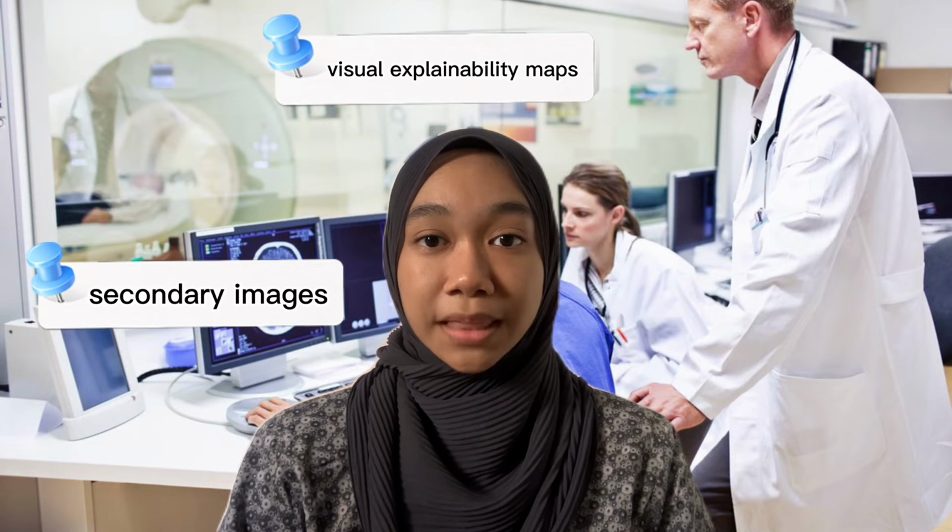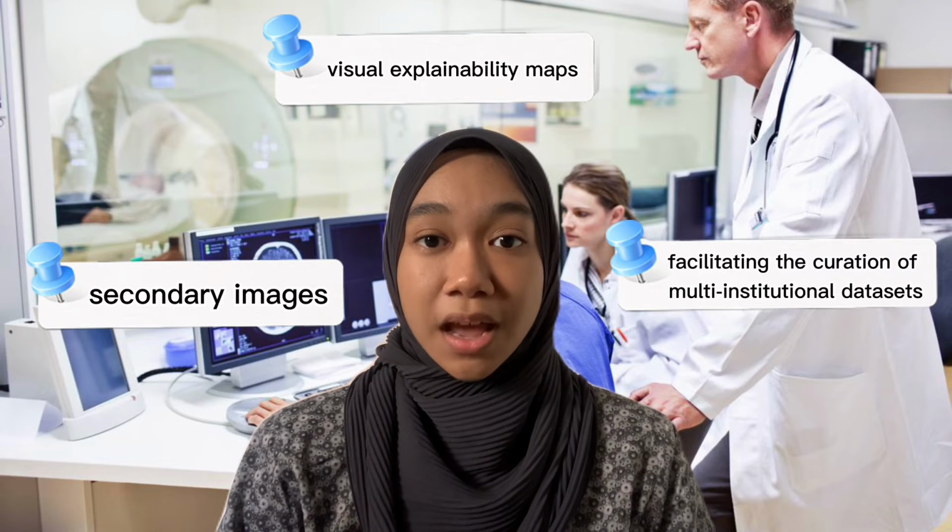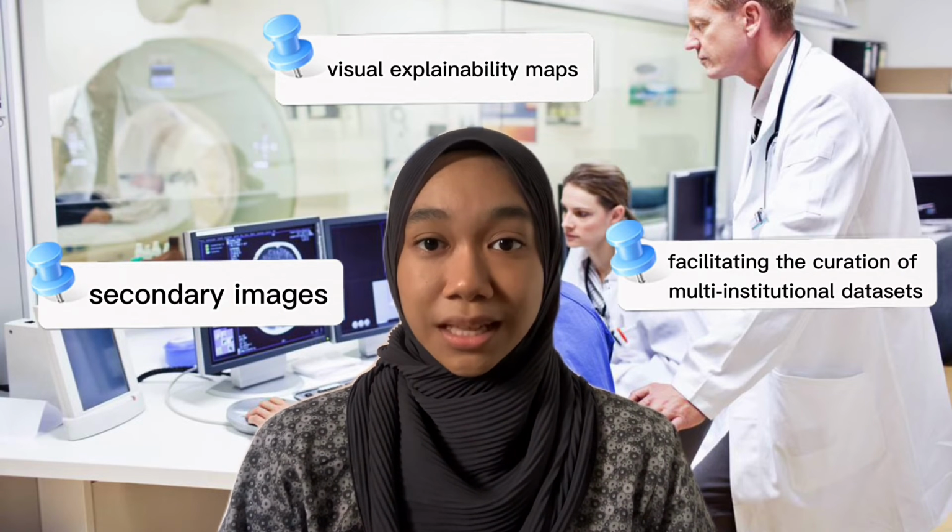By encoding derived objects such as secondary images and visual explainability maps, and facilitating the curation of multi-institutional datasets for machine learning training, testing, and validation, Dicom can improve AI workflows.